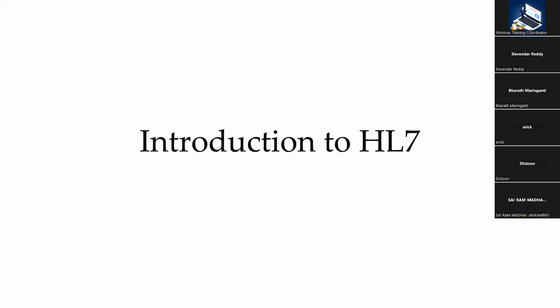Okay, so we'll go in depth about Mirth Connect. We'll start from zero, of course, and then slowly increase the level of complexity of what interfaces you can develop on the Mirth integration engine. And after that, we'll have one or two sessions at the end where we'll go through the other standards that we have in healthcare, like FHIR and CCD. I'll give a small intro about these two standards, and then I will also talk about how to prepare for certification if you're planning to get certified in HL7 V2.